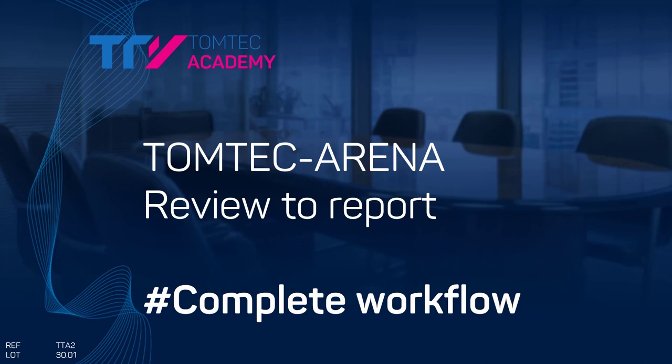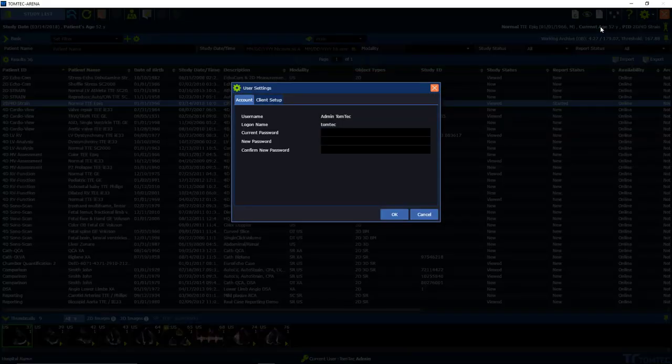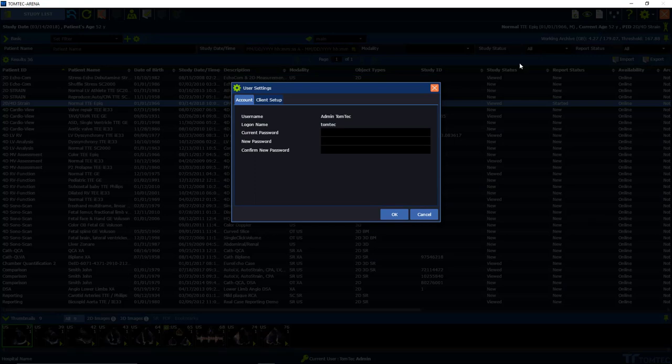How to go from review down to the reporting in the new TomTek Arena. First of all, we want to set up a dual monitor. For that in TomTek Arena, on the right upper hand corner, see user settings.